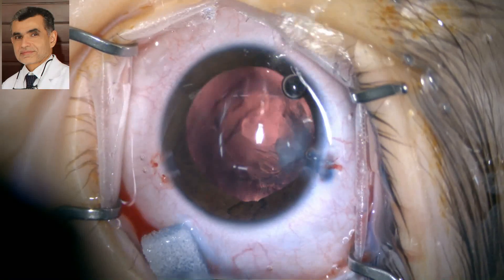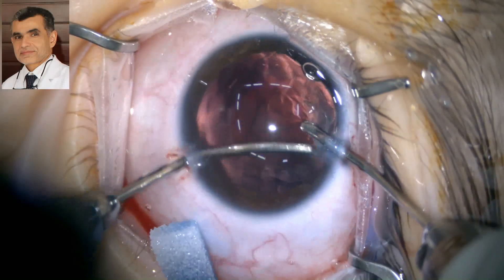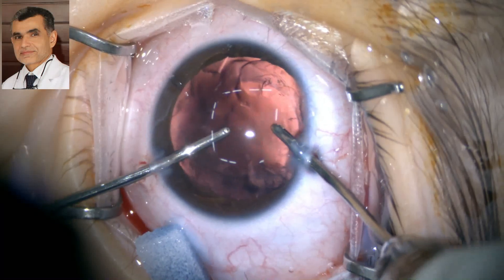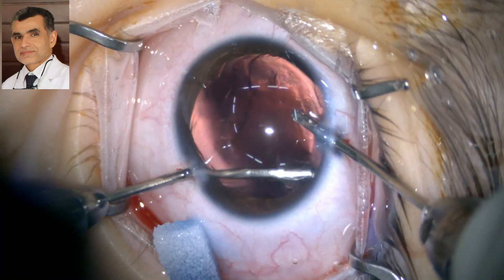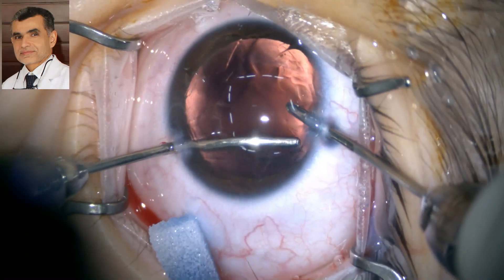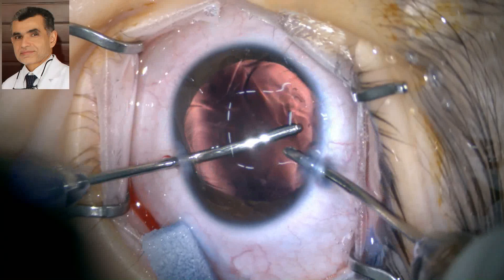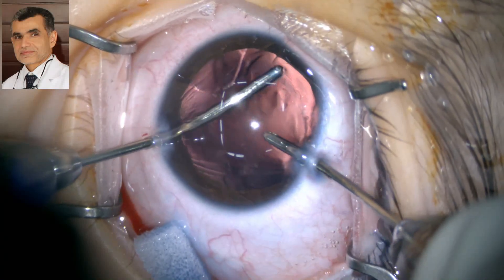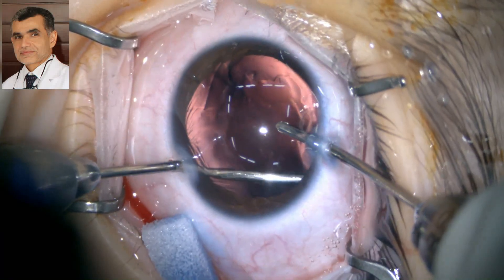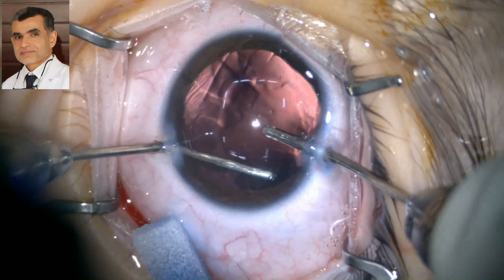In infectious cases, we also work to prevent any intraocular inflammation. We are polishing the posterior and anterior capsule using low vacuum, switching hands to remove remnant cortical matter from the other side. This is a temporal approach. The meticulous cleaning of the capsule and cortical matter is completed.